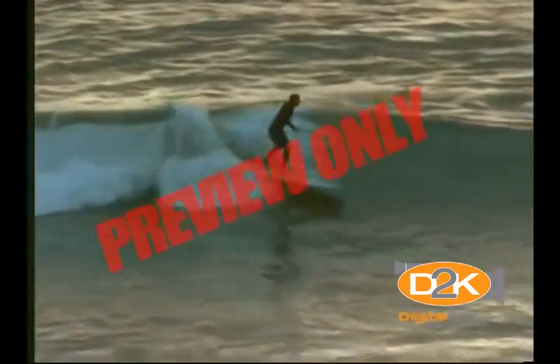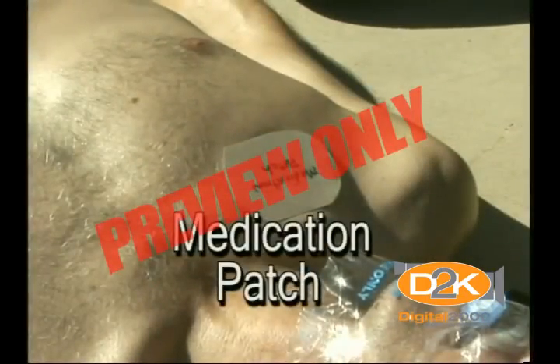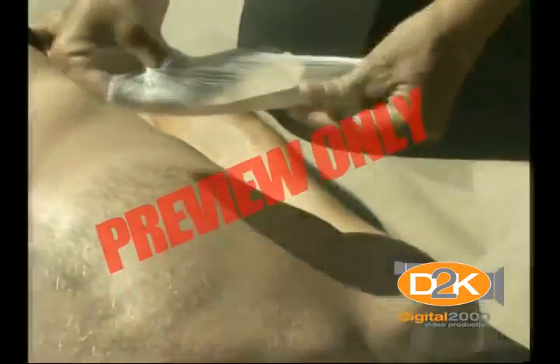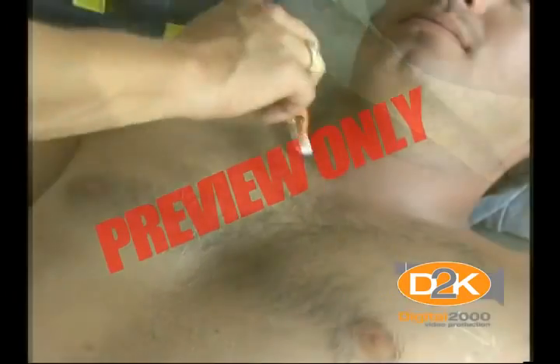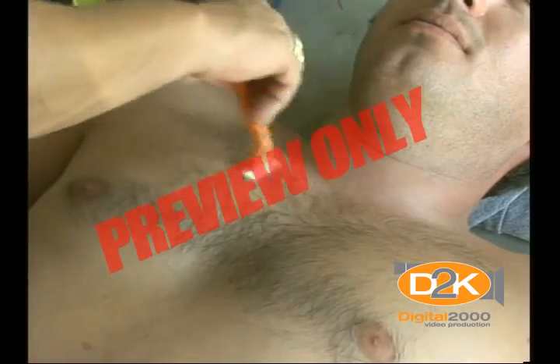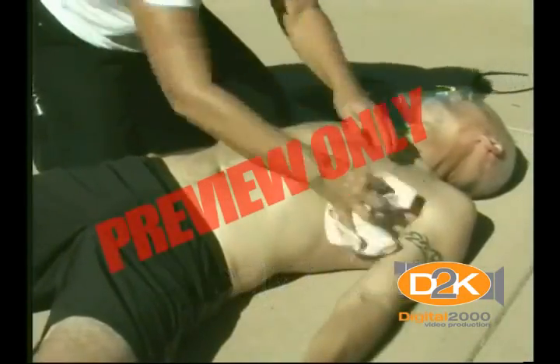Water. Remove the person from the water and dry the chest before attaching the pads. Medication patches. While wearing disposable gloves, remove any medication patch that is in the area of pad placement. Be sure to wipe the area clean with a gauze pad. Hairy chest. If someone is extremely hairy, you will need to shave the area where the pads are to be attached. Sweaty chest. A sweaty or wet chest needs to be dried before attaching electrode pads.